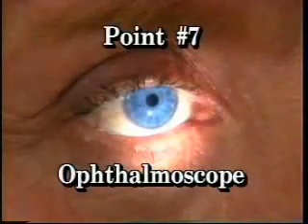Point seven: ophthalmoscope. Dial in plus eight to plus ten diopters. Back away from the patient approximately eight inches and, using your left eye and left hand to hold the ophthalmoscope, look into the patient's left eye. You should see a red reflex. As you move forward, the reflex will sharpen and you can reduce the diopters to approximate the patient's refraction. Find a blood vessel and follow it to the optic nerve. The nerve is evaluated for sharpness of the disc margin, dilation of the blood vessels, and presence and description of the optic cup. Repeat for the right eye.